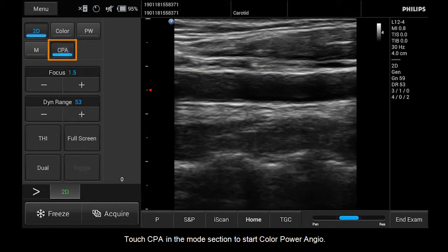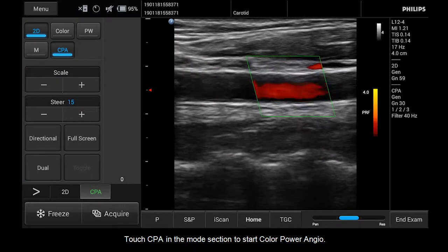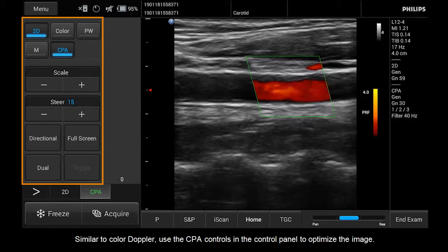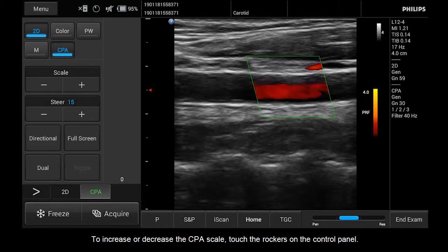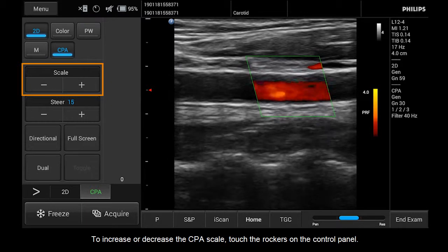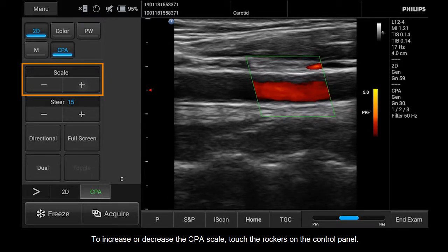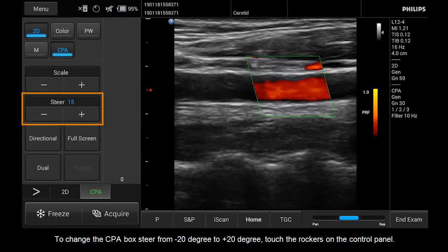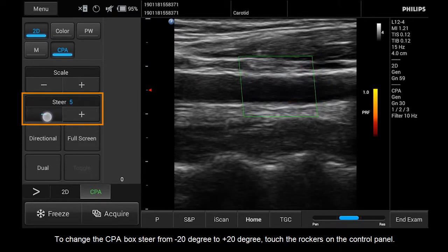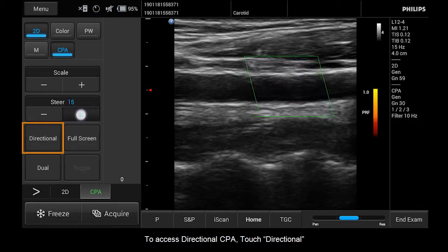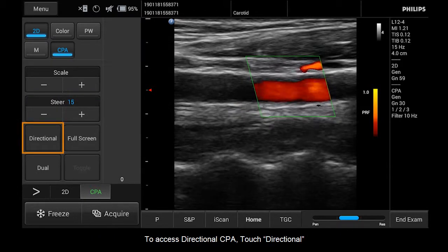Touch CPA in the mode section to start Color Power Angio. Similar to Color Doppler, use the CPA controls in the control panel to optimize the image. To increase or decrease the CPA scale, touch the rockers on the control panel. To change the CPA box steer from negative 20 degrees to plus 20 degrees, touch the rockers on the control panel. To access Directional CPA, touch Directional.